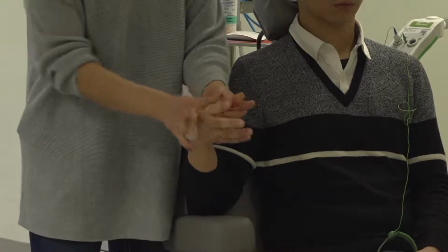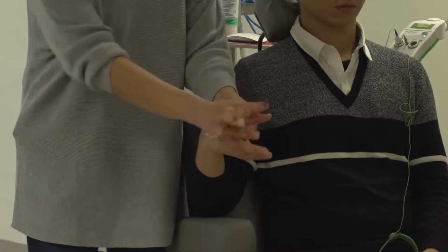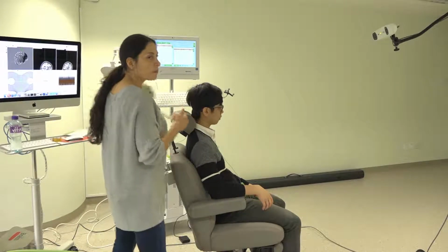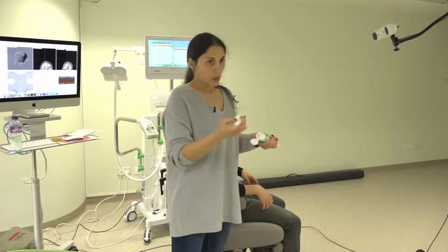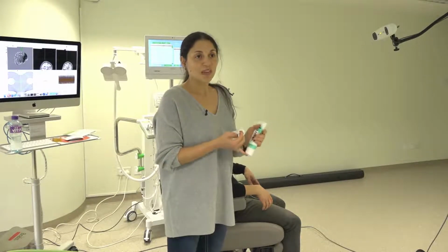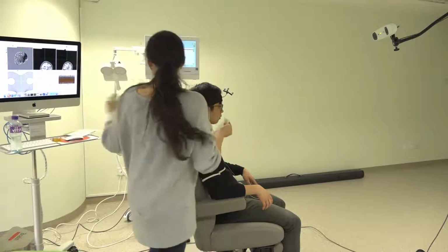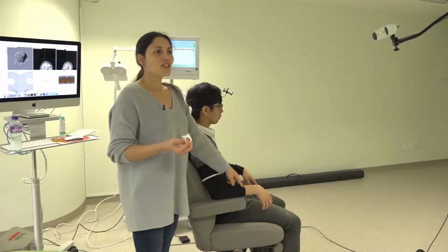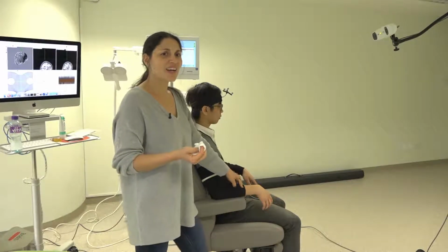Okay. In the last 4 years, I have been working with EEG TMS. And another possibility for the EEG people is that you can use the EEG system to get the EMG. So you use electrodes from the EEG to get this signal. It's so hard to get a clean signal.